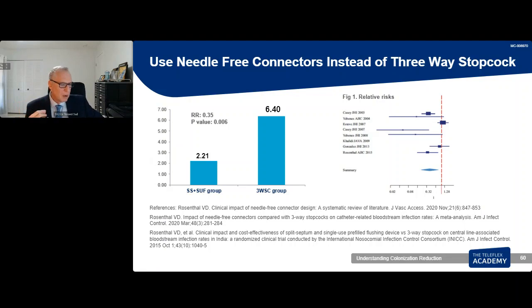For example, the one with the biggest amount of reflux is negative displacement. And you can find this in the INS guidelines published in 2021. You can find this there.